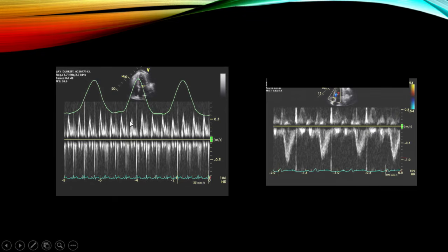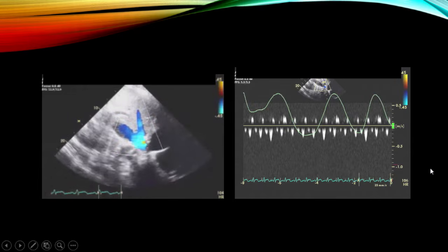Mitral inflow variation: with inspiration, you're seeing a decrease, and with expiration, it starts coming up. You also have LV outflow variation that is present. Again, IVC plethora and a little reversal you can see by color. This is your respirometer. A good attempt was made here to get it. And you can see that with expiration, there is some decrease in forward flow, but I cannot conclusively say that there is an increase in reversal here.